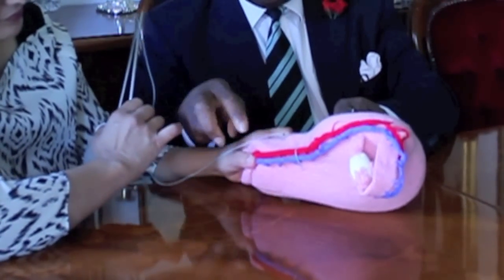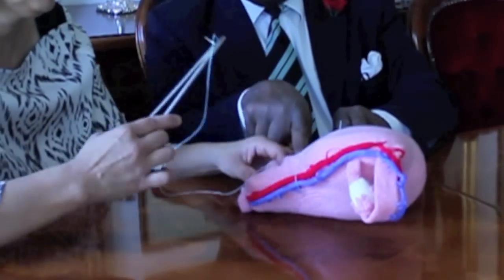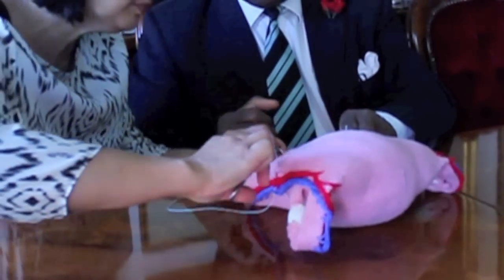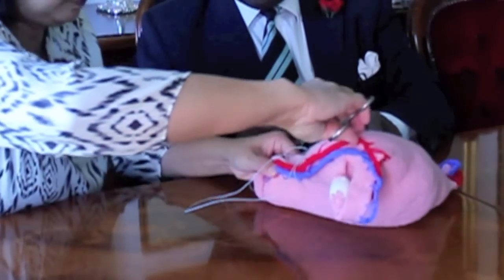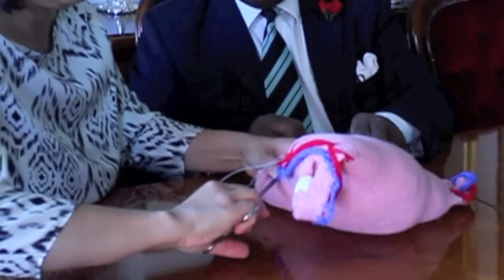Now the suture lies posteriorly in the posterior wall of the cavity of the uterus to come from inside out, 3 cm below the lower incision margin.